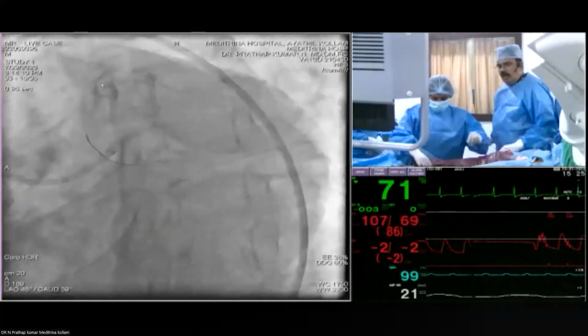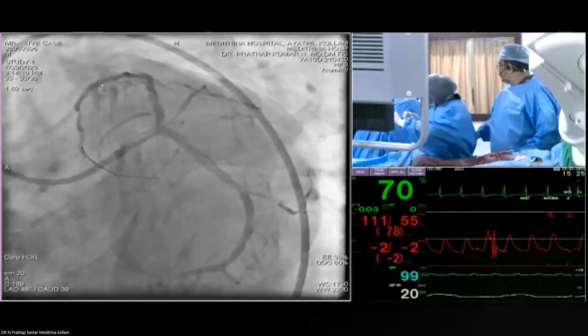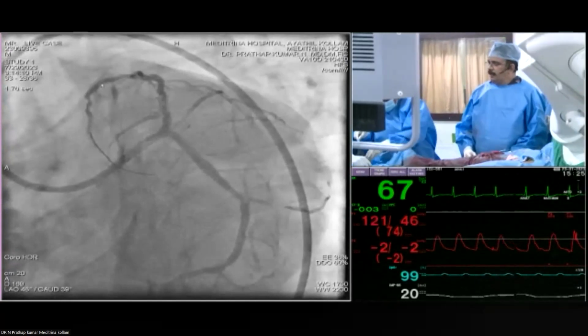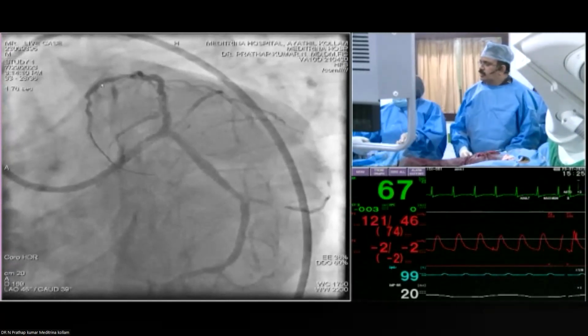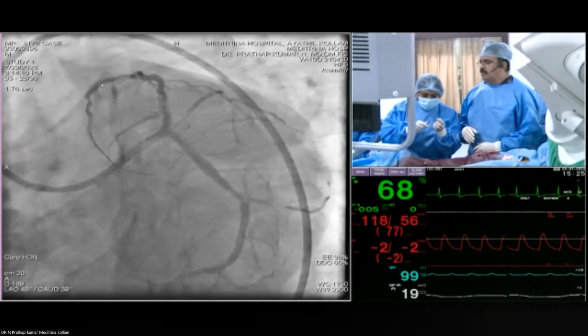No, but now I will recross. You have to go now with the POT. Can you just give me the POT and then the recrossing. People recross after a POT. I can actually recross, even try without a POT. No, ideally you have to do it step by step.